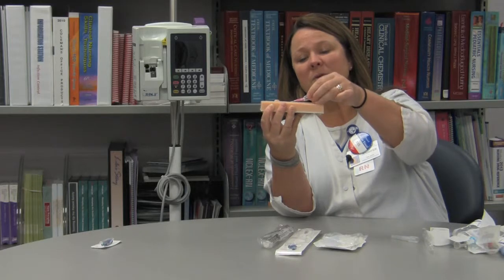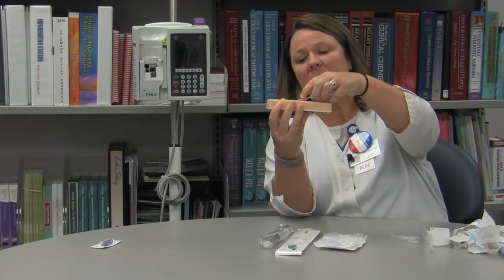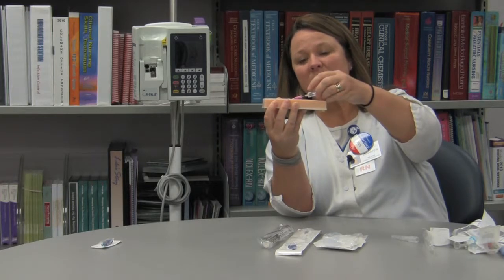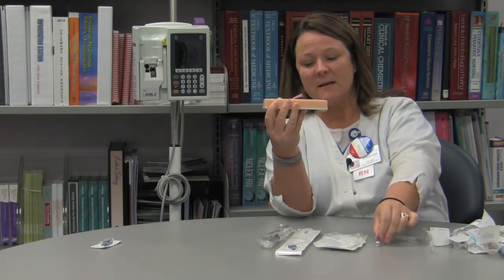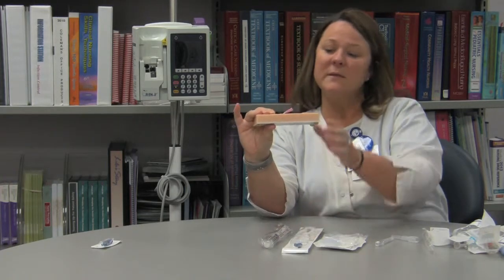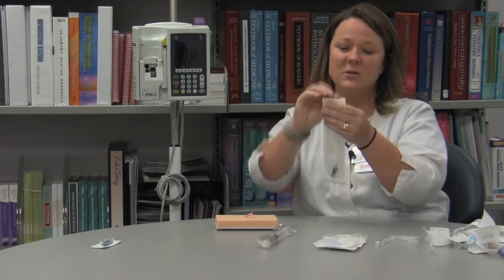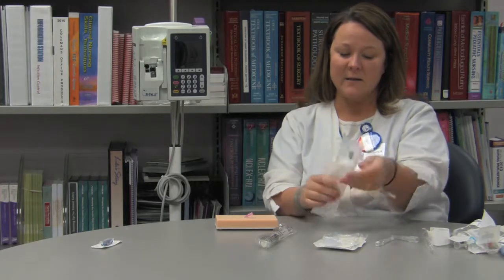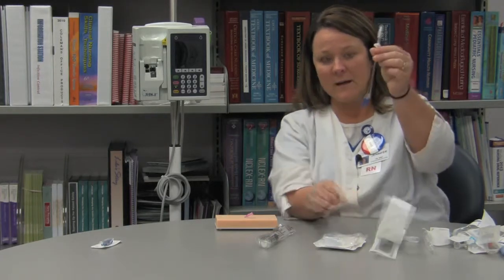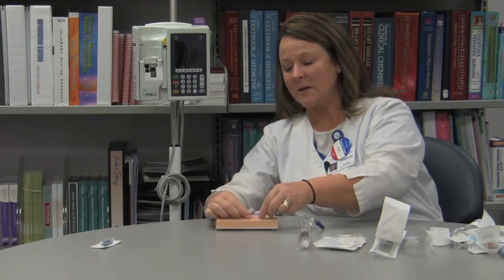Then, of course, you would pop your tourniquet. This has a little notch on top if you're a one-handed threader. You would thread your Cathlon in, leaving your needle still, and then when you're ready, you would hit your white button to retract the needle so that you can set that down. Of course, I would be holding right here so we're not bleeding back everywhere. One thing we also do here at White County is attach the extension tubing to the angiocath. You would want to have this ready and flushed, and then attach it to the angiocath.